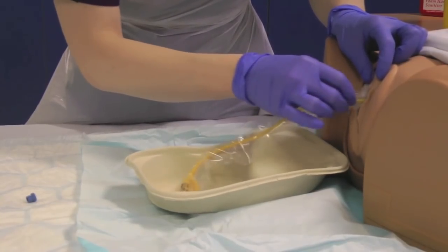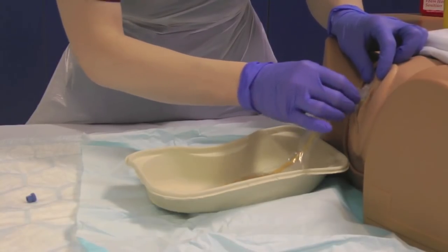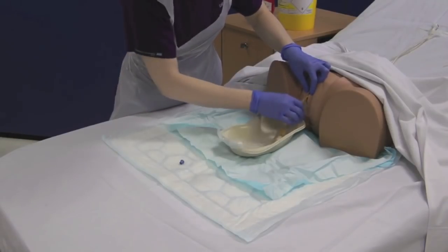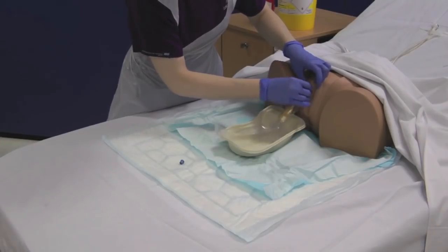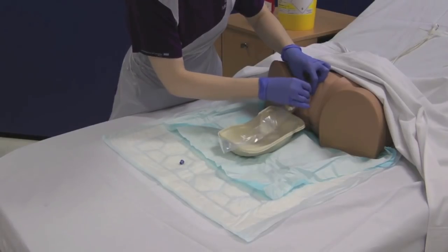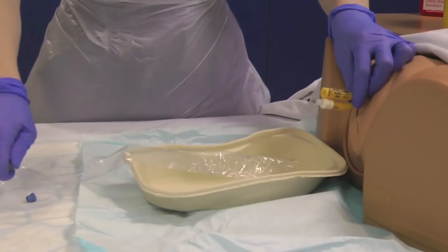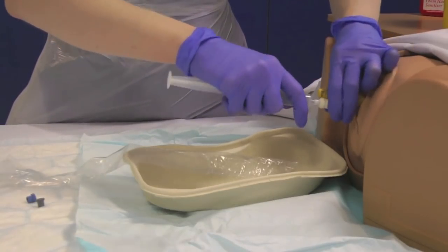You may need to part the labia at this point. Insert the catheter along the urethra into the bladder. If there is any resistance, ask the patient to cough, which may ease insertion. Never force the catheter. Once the urine starts to flow, advance the catheter a further 5 cm. Take your 10 ml of sterile water from your sterile field and inflate the balloon, observing the patient for any signs of discomfort.